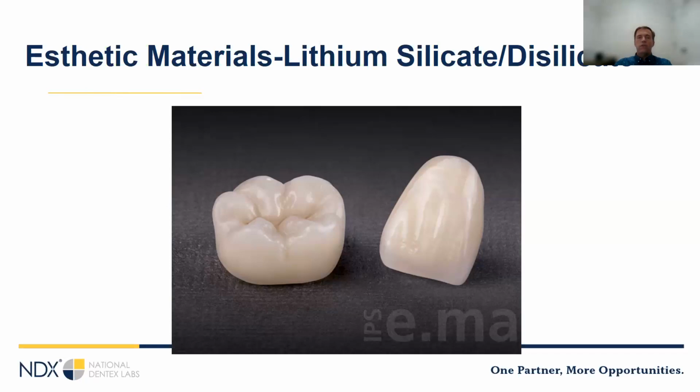So you can see that following a predictable workflow that starts with thorough treatment planning can make full arch or full mouth cases a predictable part of clinical and laboratory treatment. When the provisionals have already shown the patient the final results for the case, much of the stress in making and delivering the final restorations is eliminated. Your delivery appointment is going to be much less stressful because everyone knows what to expect.